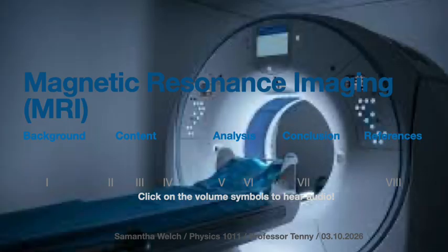Research described in a review article available through the National Institutes of Health PubMed Central Database explains that an MRI is especially useful because it provides extremely high contrast between different types of soft tissue.